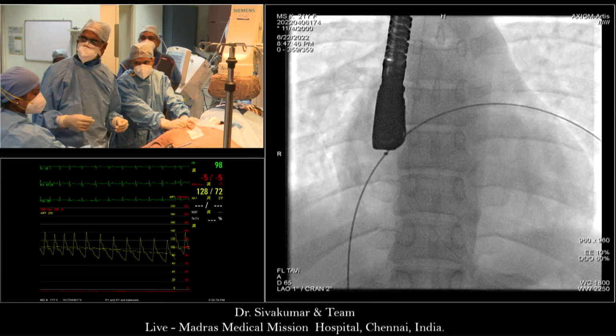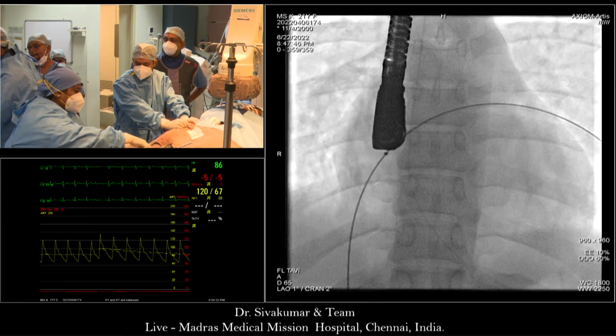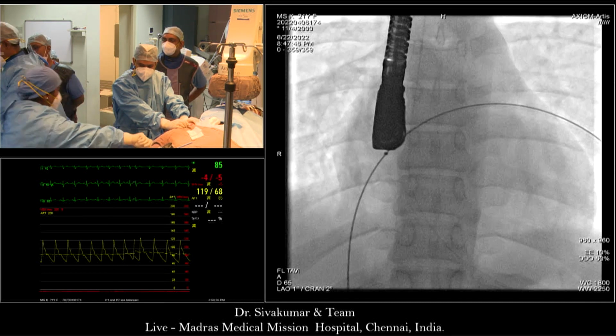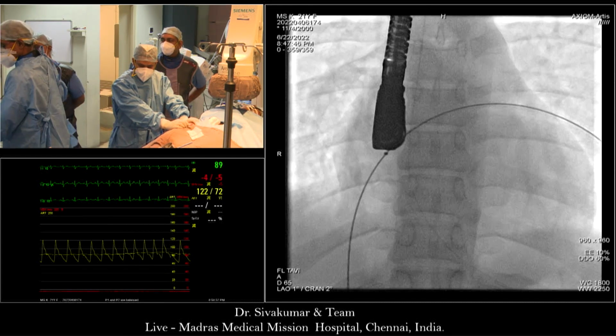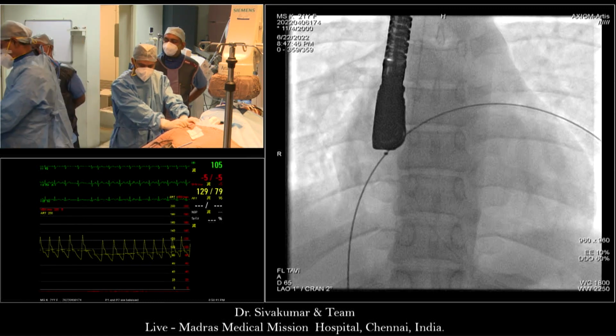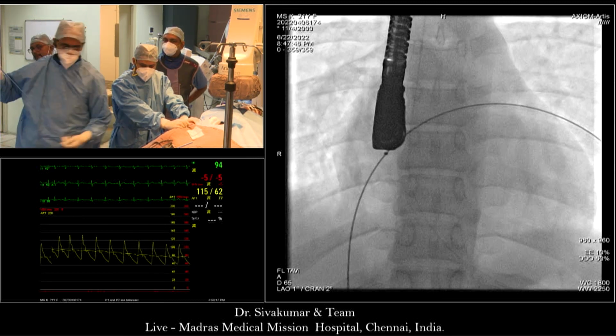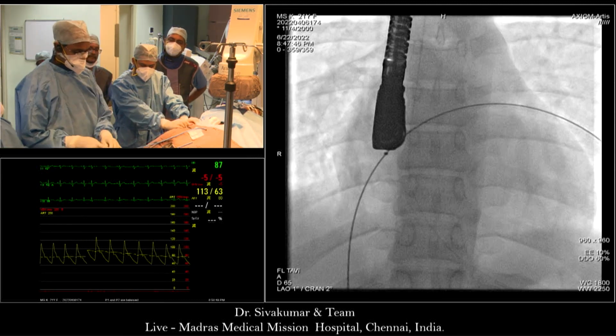I think that's going to irritate Stephen, so we're not going to ask him that. We won't let him hear that. But it's a good idea. Yes, I think we all agree that 40 is oversized. We all agree that 36 is undersized. So a few millimeters less, with 38, it may work.